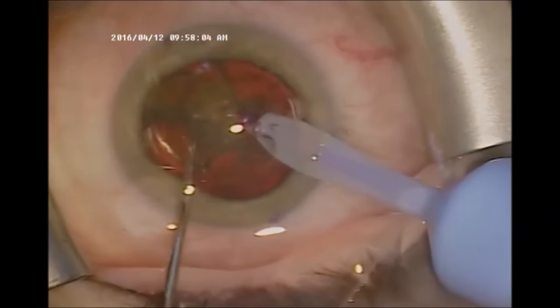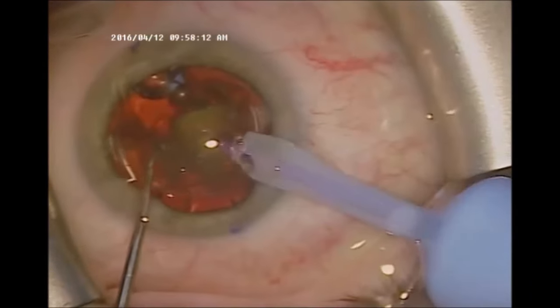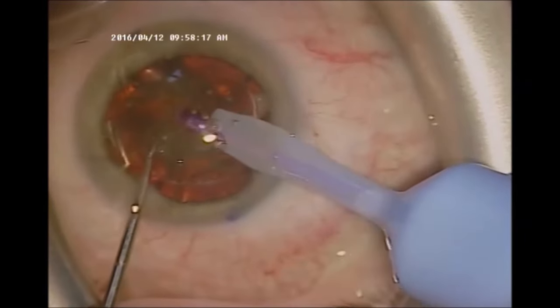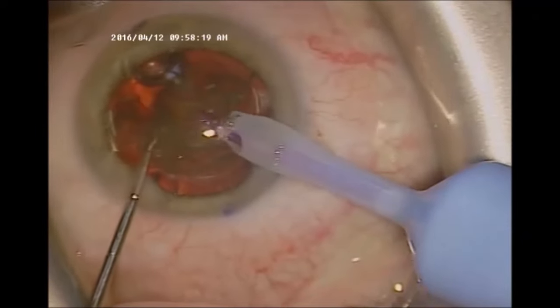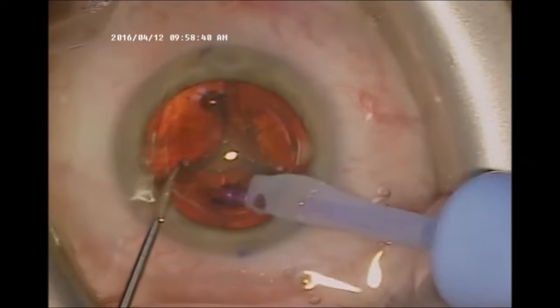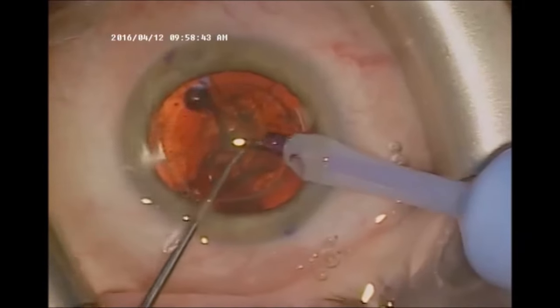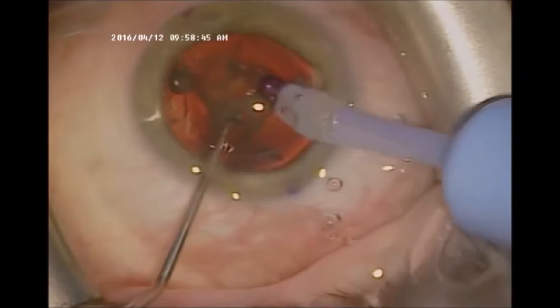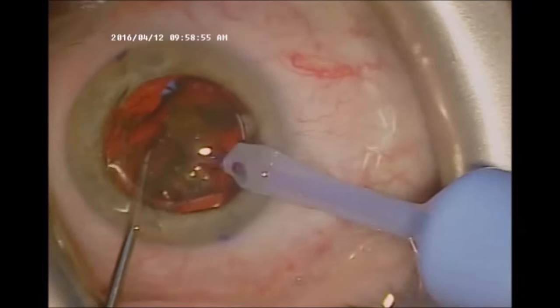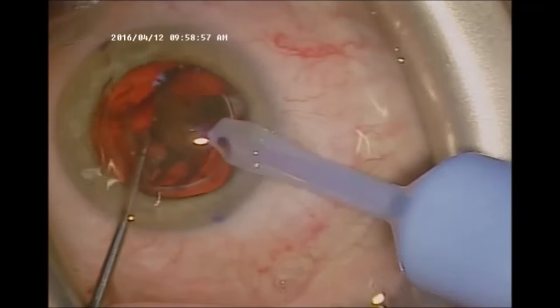And then I use the aspiration or the vacuum in order to remove the pieces. Here you can see one segment being removed and aspirated. And then we move on to a little bit later in the case, removing another segment. And here we rotate the lens, which has been freed from the capsule previously. Here we have yet another segment to remove.